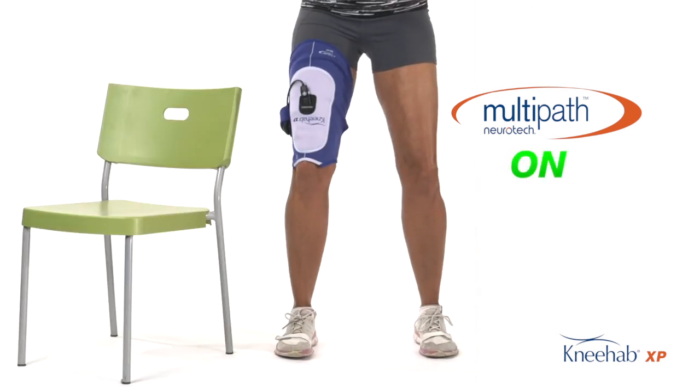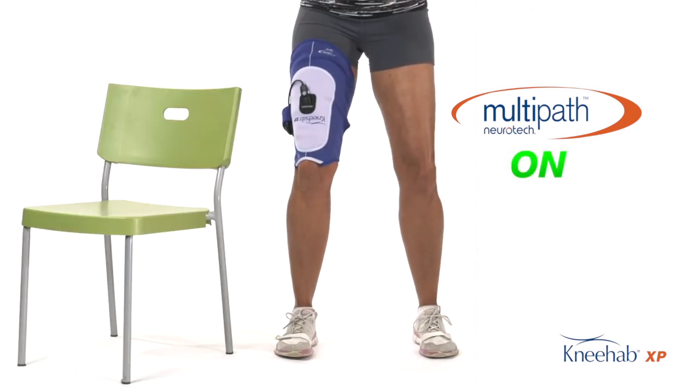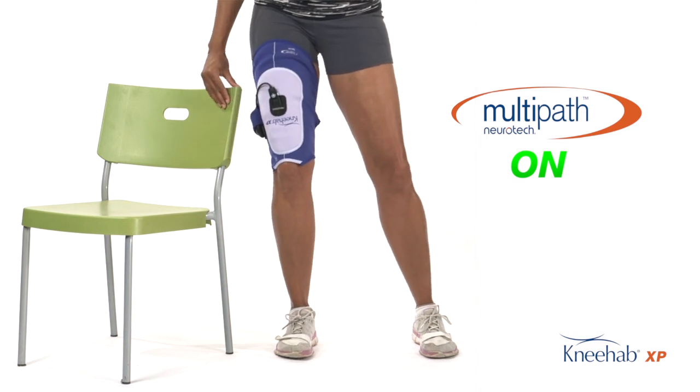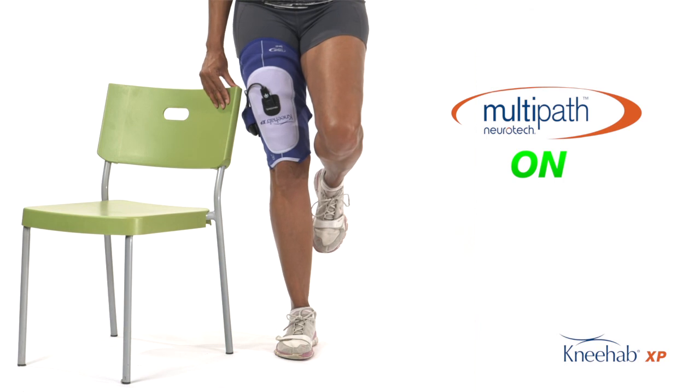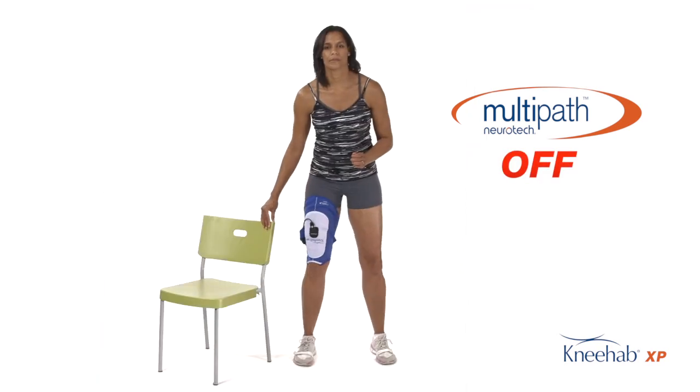Again, the patient is in slight flexion, shifting the body weight over and squeezing with the device when the contraction is felt to come on. The knee is maintained in flexion. Please use a chair or a countertop for balance support.